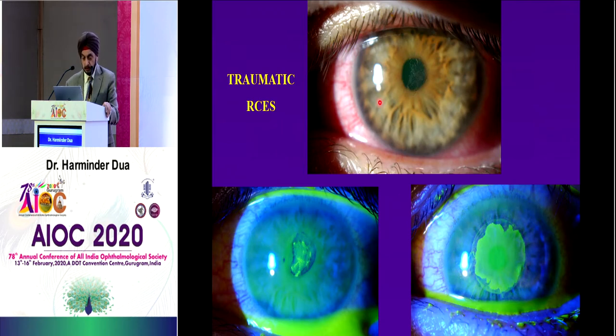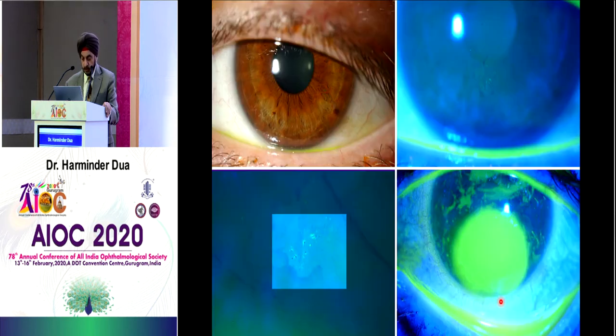This is how the patient looks on the diffuse view. Negative, positive staining, alcohol delamination is another example. Some patients of recurrent corneal erosion, you don't see clinically anything until you look for it. And if you look for it and put fluorescein 2%, dilute it, wait a few seconds, let the tear film break up, and you will see very subtle intraepithelial microcysts. That is how they look. Some of them have burst, causing positive staining. Mostly they are negative, and that can cause excruciating pain and the whole syndrome of recurrent erosion. So that's it after alcohol delamination.